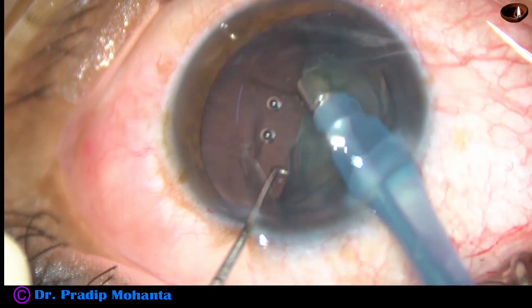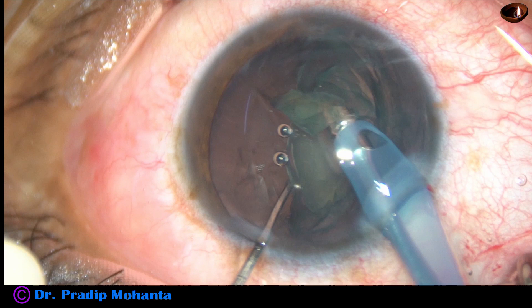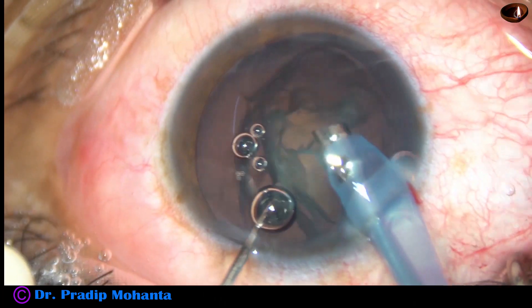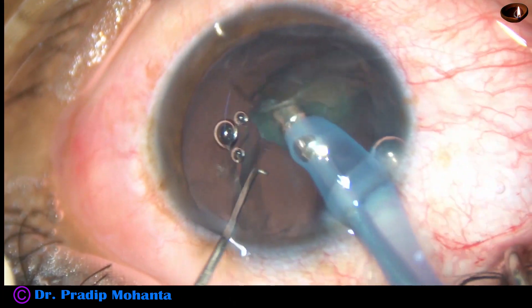Half of the lens mass is removed bevel down. Then the handpiece is rotated, bevel is made up, and the rest 50% is removed by bevel up position.